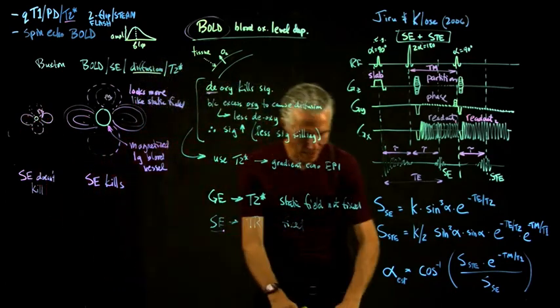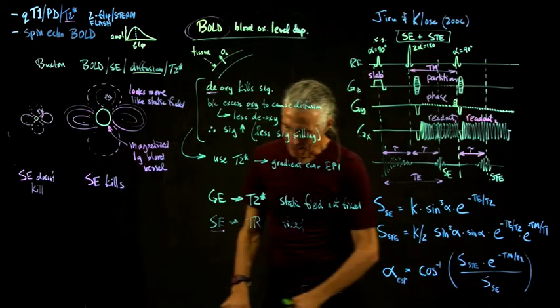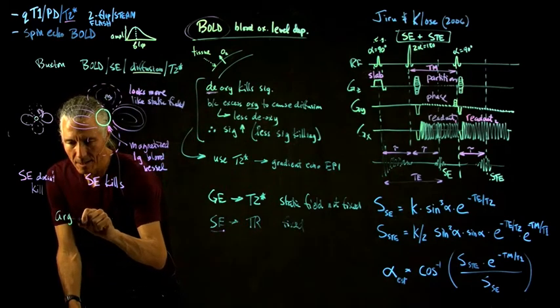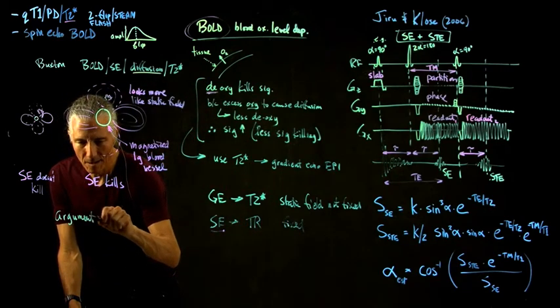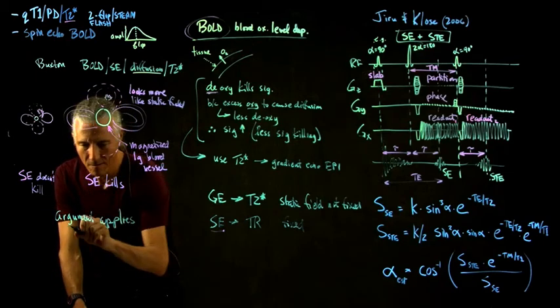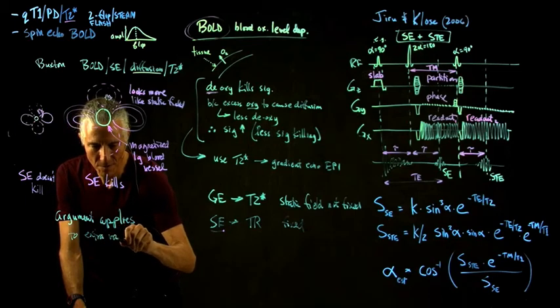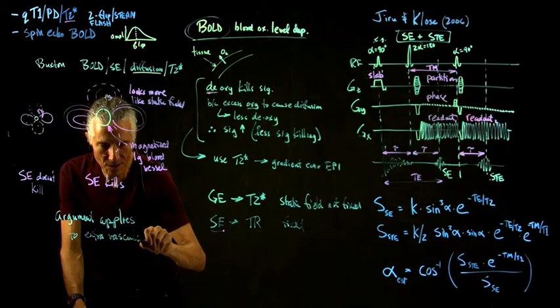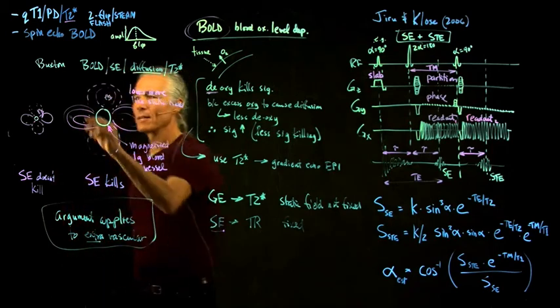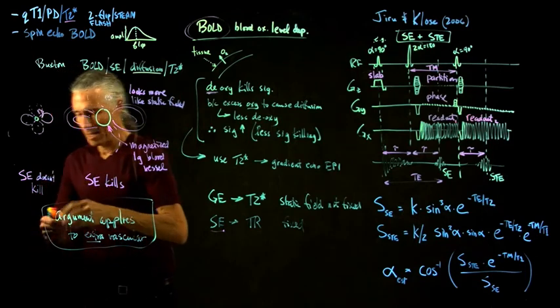Remember, this argument applies to extravascular, so it applies to the tissue around the blood vessel. So here's the little capillary. This guy is a capillary.